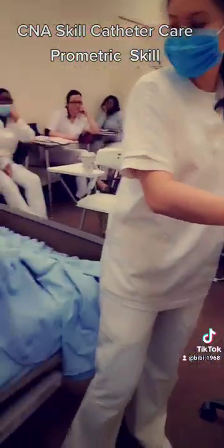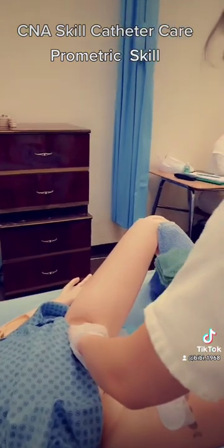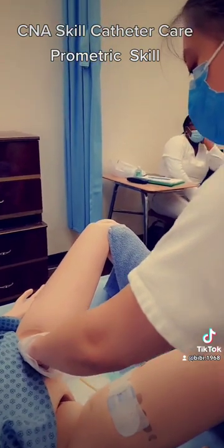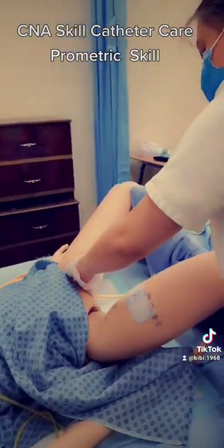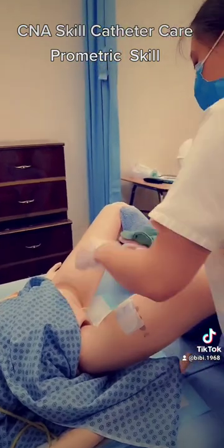Okay, so I'm going to be rinsing that off. So holding it again at the tip with these four corners, supporting the catheter at the meatus to prevent the catheter from dislodging. One, two, three, four.